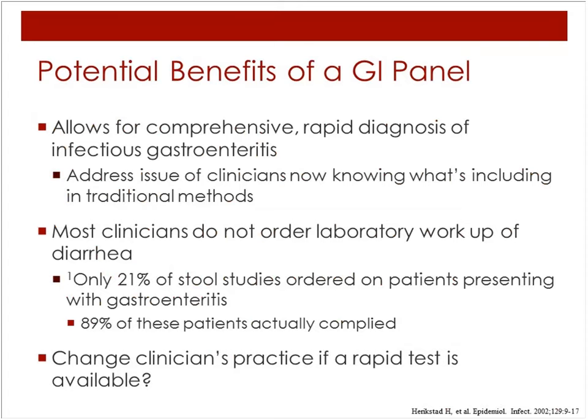So, some potential benefits of the GI panel in your institution. Implementation of the panel to replace traditional methods can allow for rapid and comprehensive diagnosis of gastroenteritis. This addresses the issue that physicians often do not know which pathogens are detected in stool examinations. This insufficient physician knowledge could have negative consequences for patient care as well as for public health.